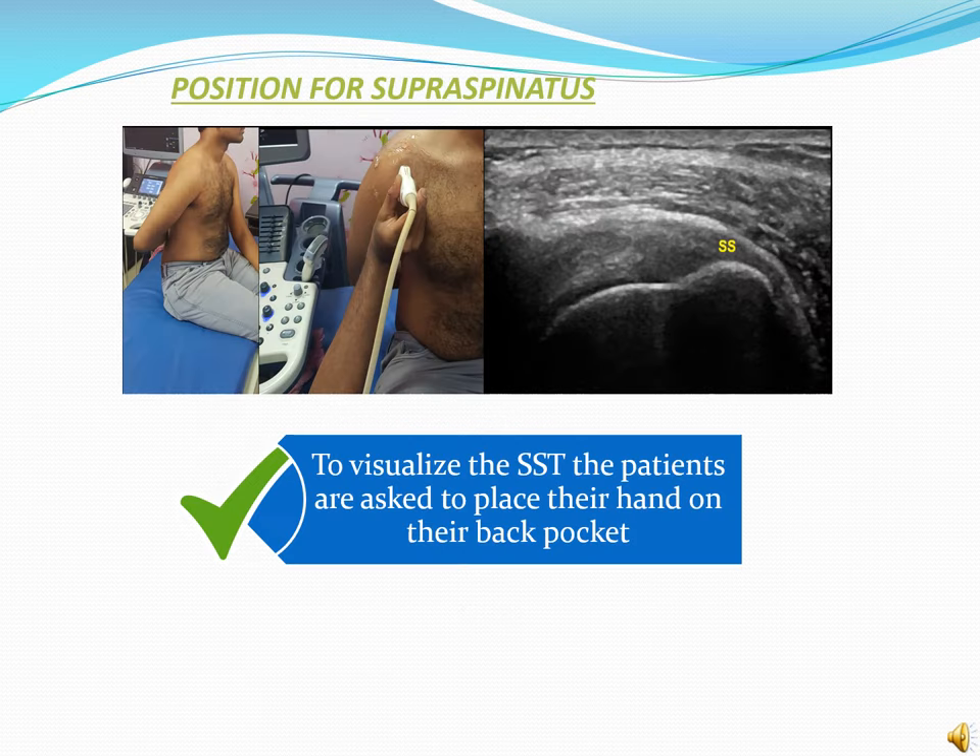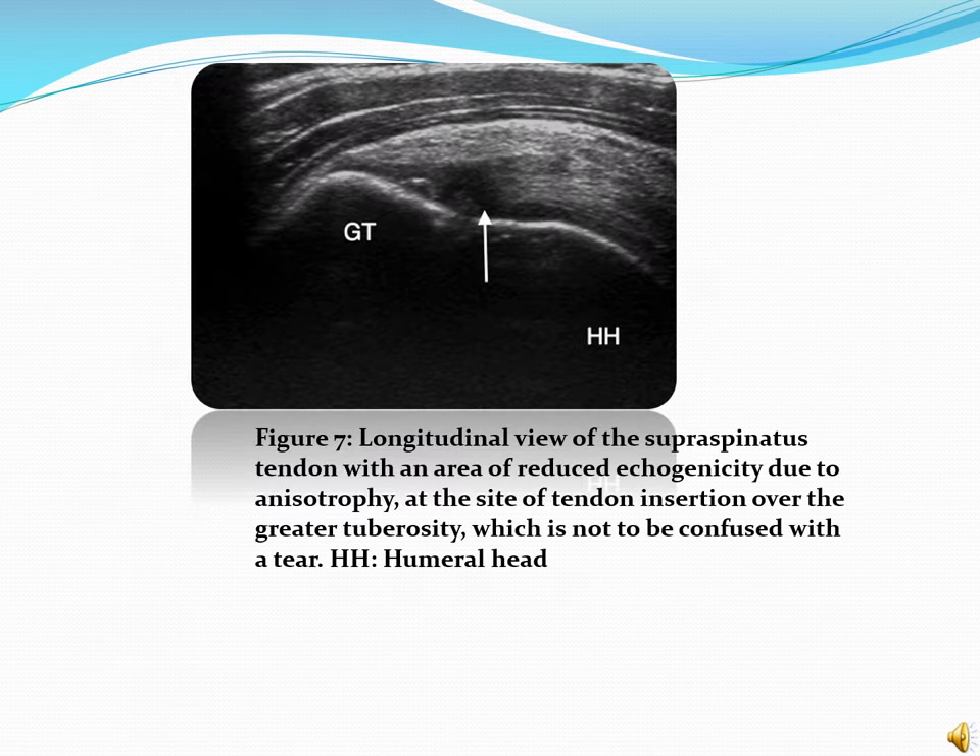This image shows the position of the patient for evaluation of the supraspinatus muscle. To visualize the supraspinatus muscle, patients are asked to place their hand on their back pocket. This image shows a longitudinal view of the supraspinatus tendon with an area of reduced echogenicity due to anisotropy at the site of tendon insertion over the greater tuberosity, which is not to be confused with a tear.